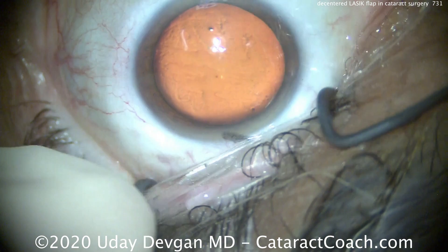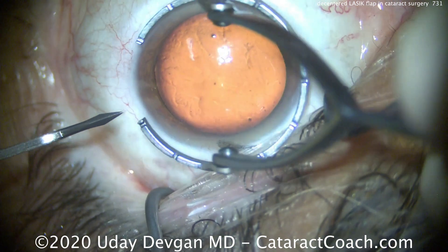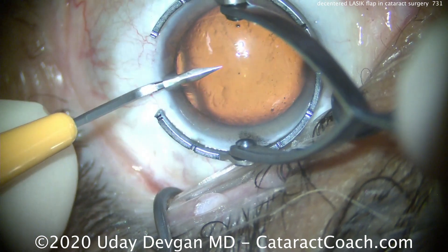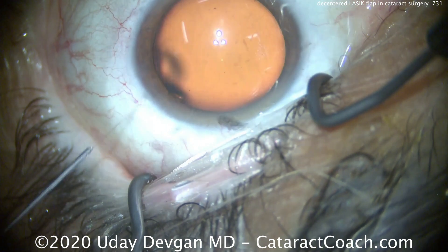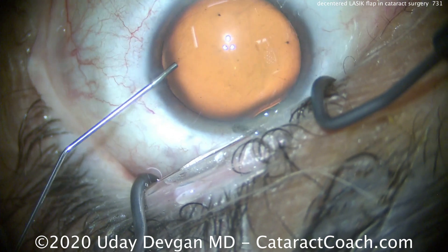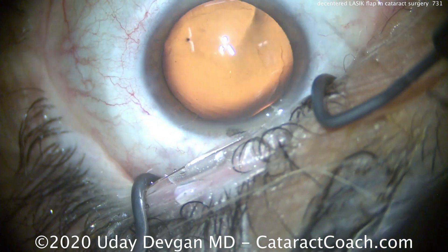So we're sitting superior. We're going to make a small paracentesis very carefully to avoid the LASIK flap edge right at the limbus — and that looks good. This eye, the ablation luckily was reasonably centered, and that's helped a lot. But the patient still has some degree of irregularity in the astigmatism.